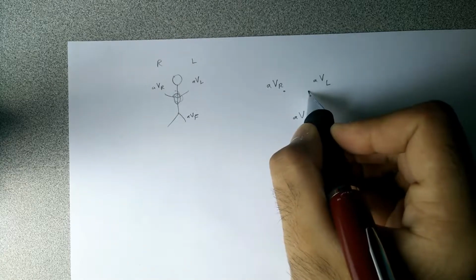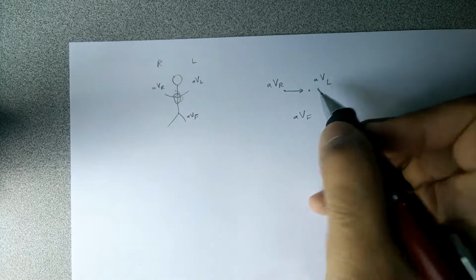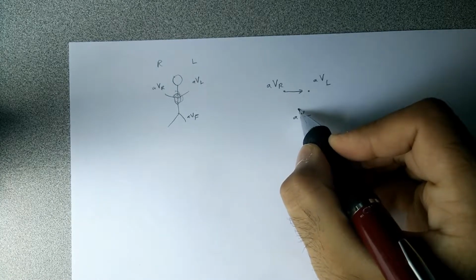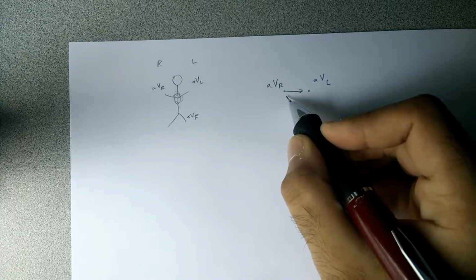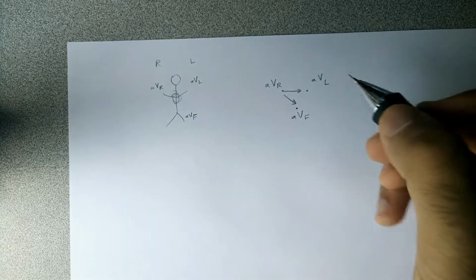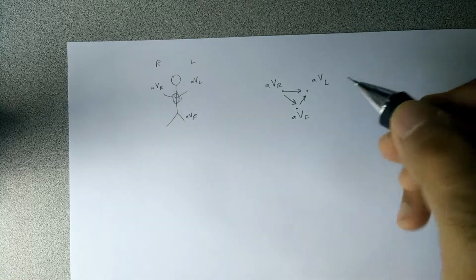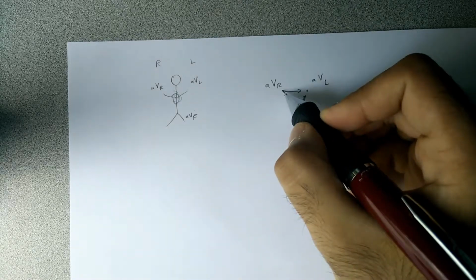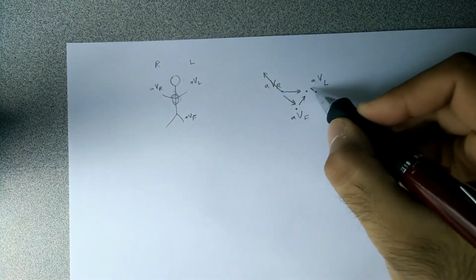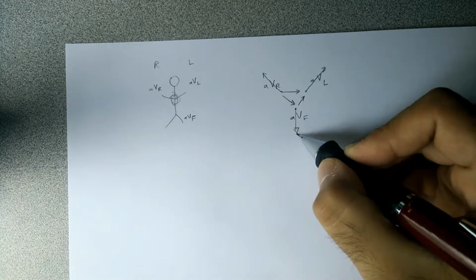If we go from AVR to AVL, we can have a new lead in this direction. If we go from AVR to AV foot, we can have a new lead in this direction. And if we go from AV foot to AVL, we can have a new lead in this direction. AVR's direction is this, just like previously talked about. AVL's direction is this, and AV foot is down.